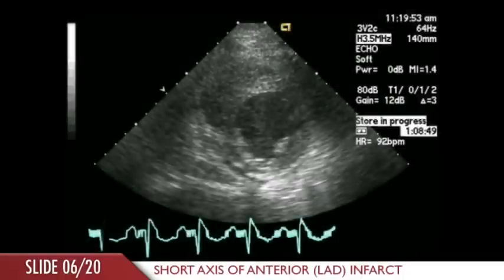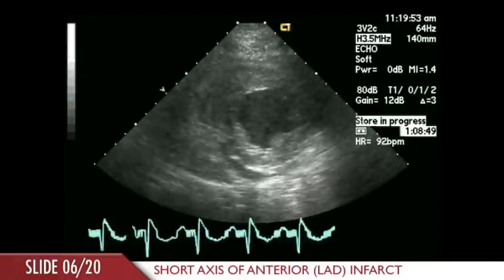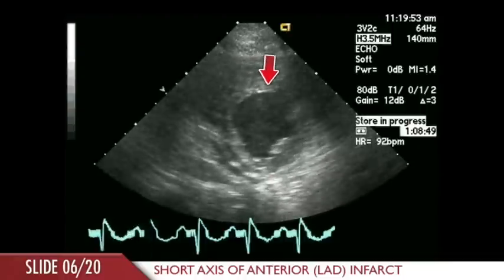This short-axis view was recorded in a patient with an acute left anterior descending distribution myocardial infarction and is analogous to the previous schematic. Note in the real-time image the absence of thickening in the left anterior descending territory.